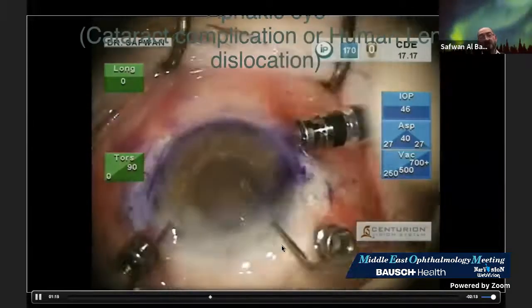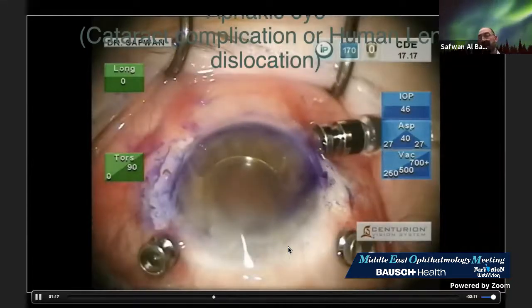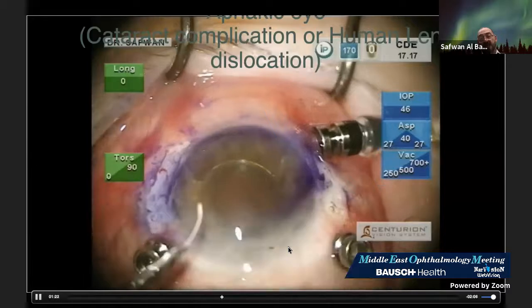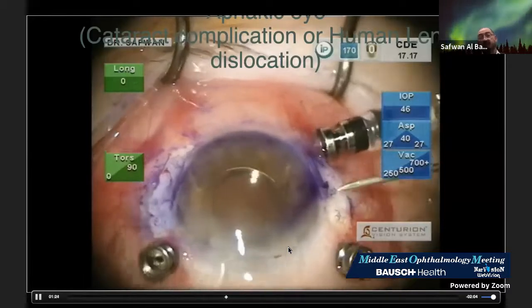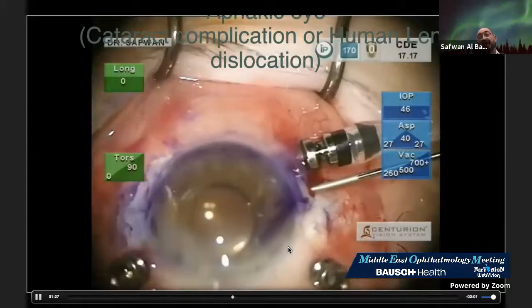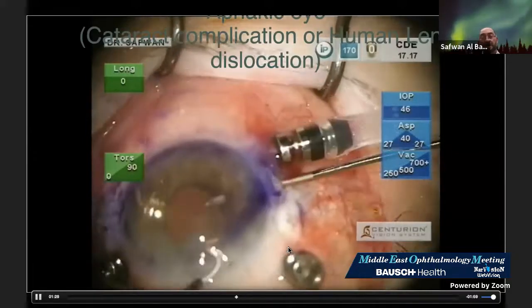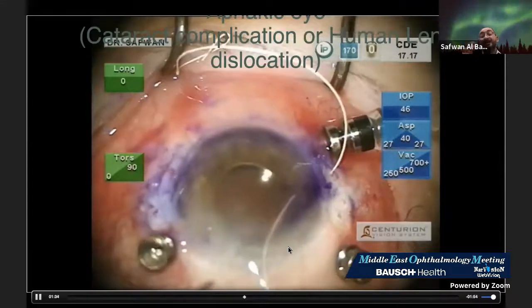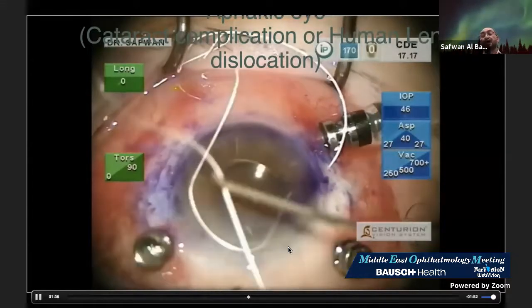Here, we will start with the right or left according to the surgeon's preference, grasping the one end from the left and right, grasping with the micro tying forceps, go through the sclerotomy side, then the tip through the eyelet, grasping it out, externalize the one side. There is no jam of the suture inside the eye.